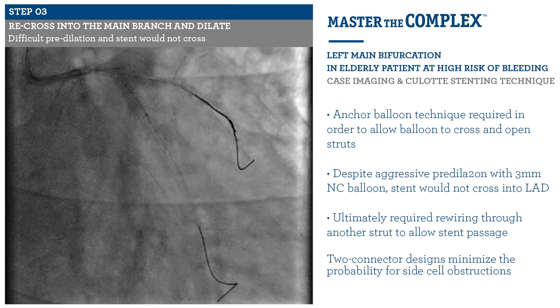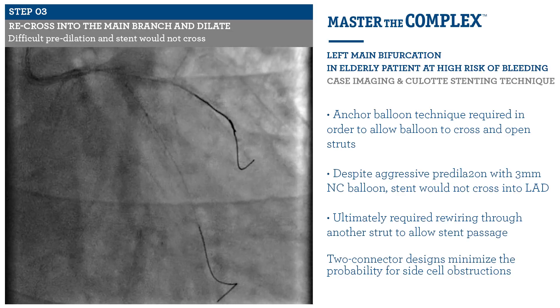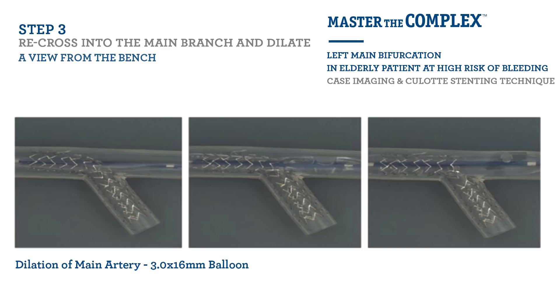We then serially pre-dilated up to a 3 mm non-compliant balloon. Unfortunately, despite this, no stent would cross, and we therefore had to rewire through a different strut from the left main stem into the LAD to allow stent passage. This possibly highlights that there was a connector obstructing the lumen, limiting the passage of a stent into the LAD. Going back to our bench model images, you can see how we use a balloon through the sidewall of the stent in order to create space for stent passage.